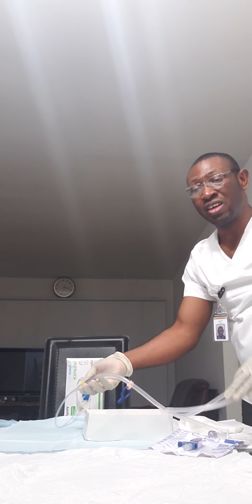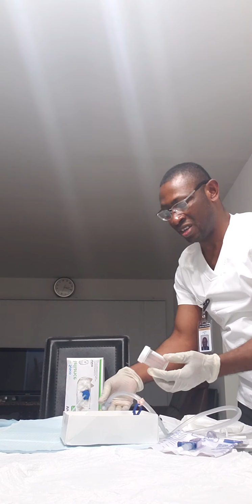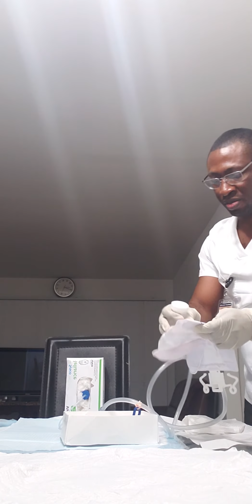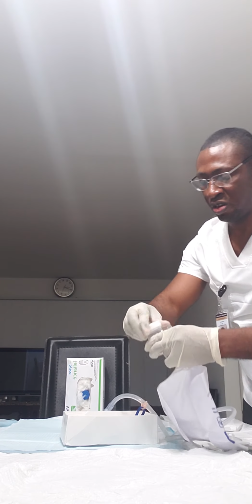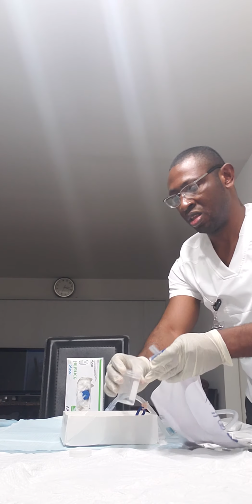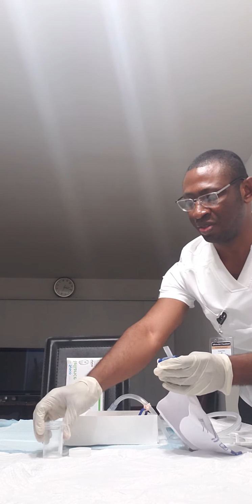If I need a sterile urine sample, I go ahead and open the lid, get my sample, and after the sample, I close it back.